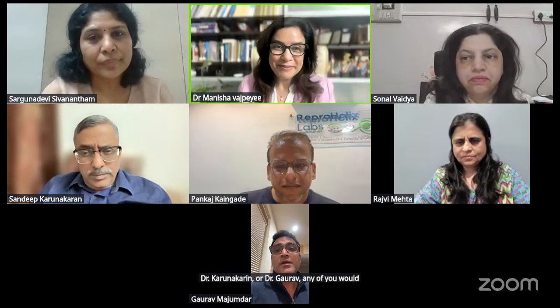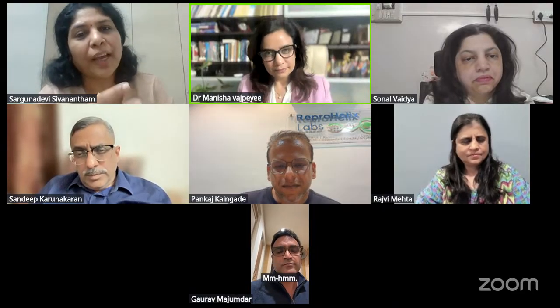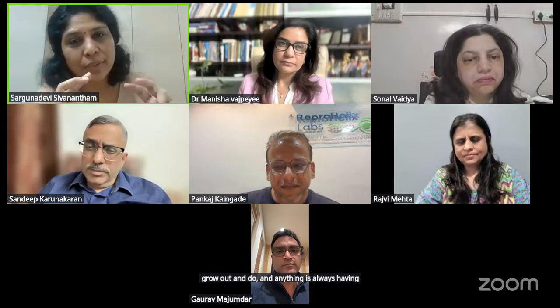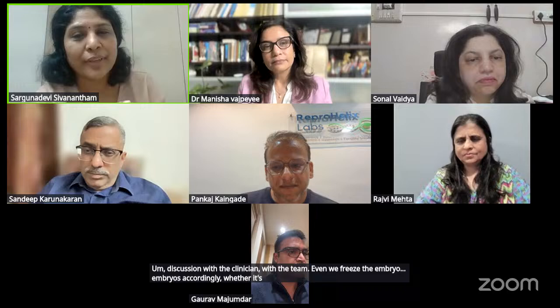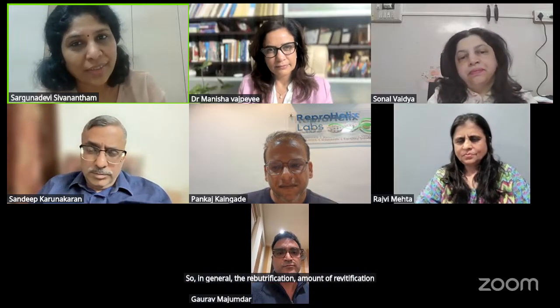Dr. Karunakaran or Dr. Gaurav, would any of you like to comment on it? I would like to add one more point to the previous discussion, about revitrification in non-biopsied embryos. For some patients, you may have to freeze them early, day 3 or day 4, and may have to do a grow out. It always needs a proper customized discussion with the clinician and the team. We freeze the embryos accordingly, whether single or double, so that we do not waste or go for revitrification. In general, the amount of revitrification we do in the laboratory is very, very minimal.